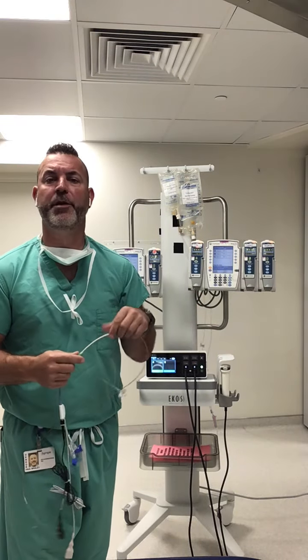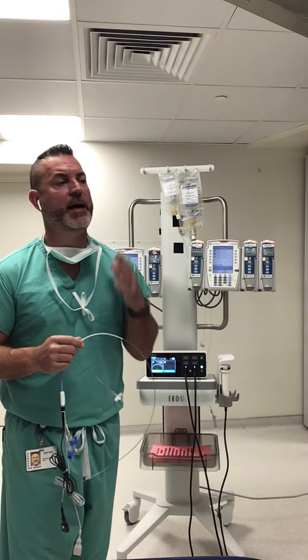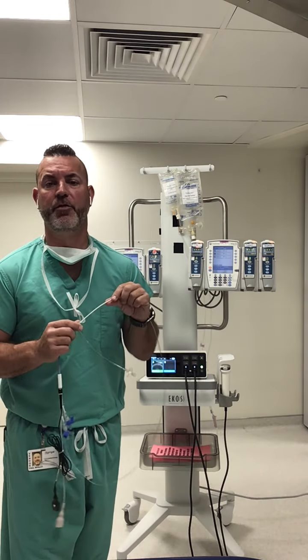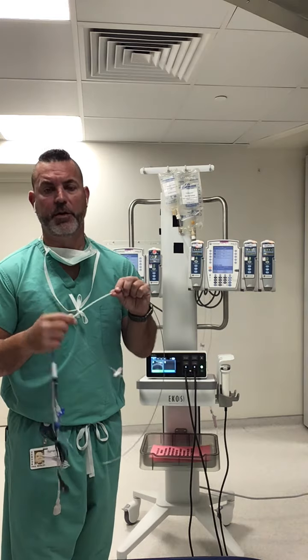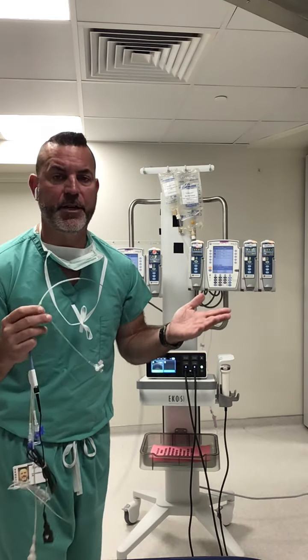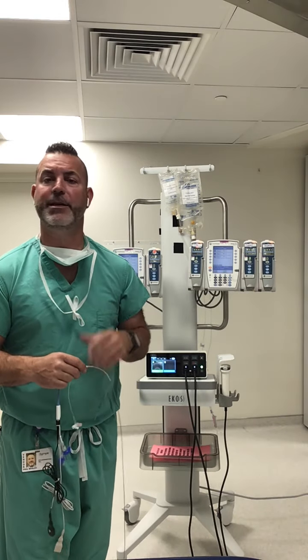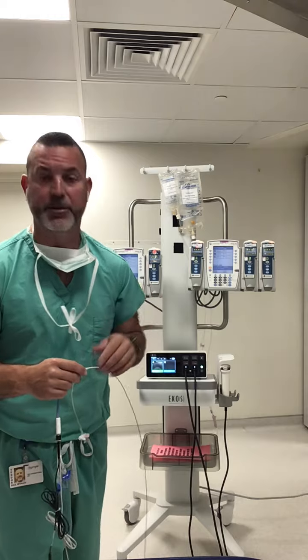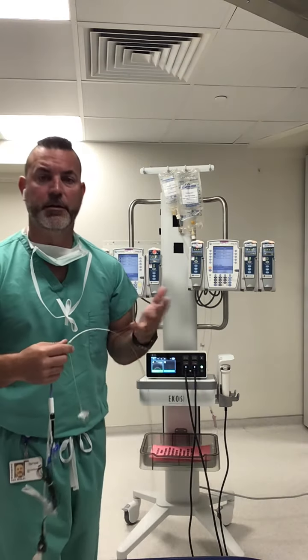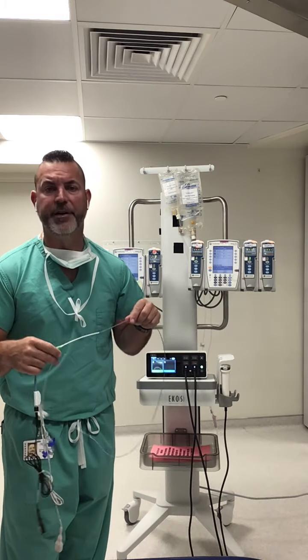How your physician wants to run heparin, if they want to run it at all, is strictly up to them. I'm just giving you examples of what you are normally going to see with your EKOS. So heparin, side arm of the sheath, 300 to 500 units per hour. It's a fixed, non-weight-based dose of heparin, so it is not a titratable dose for all of you out there who are titrating your heparin doses based on a weight-based algorithm for your labs.